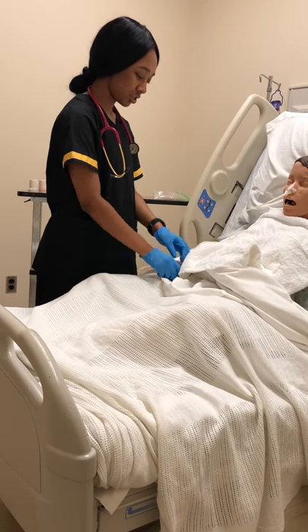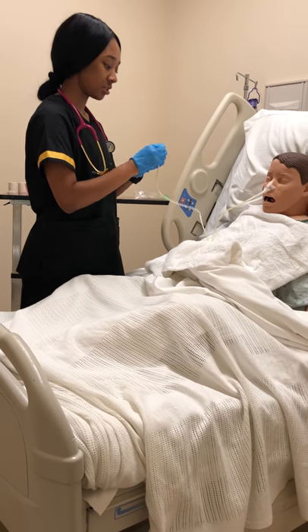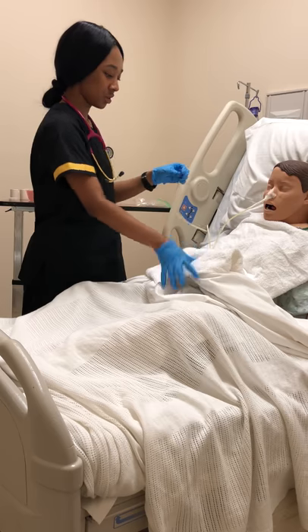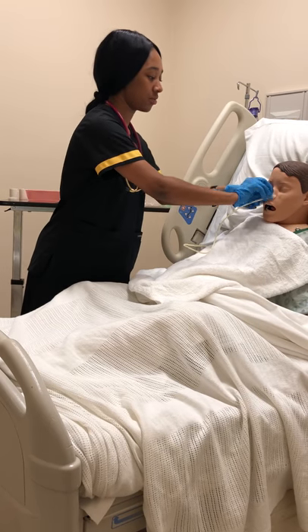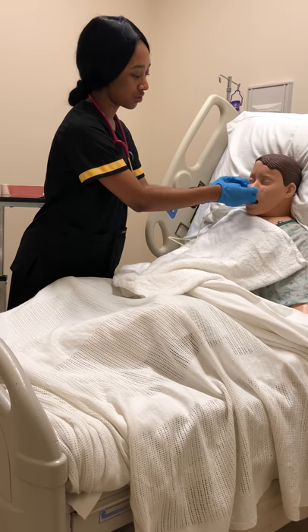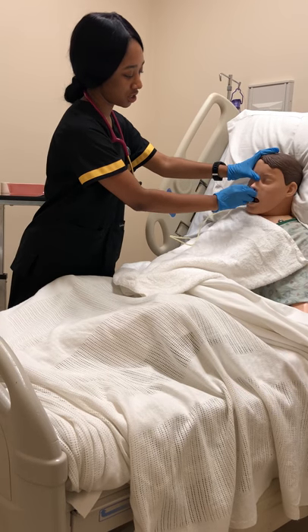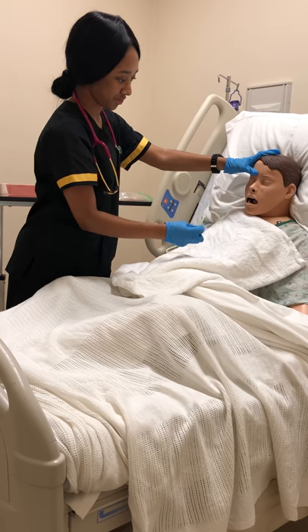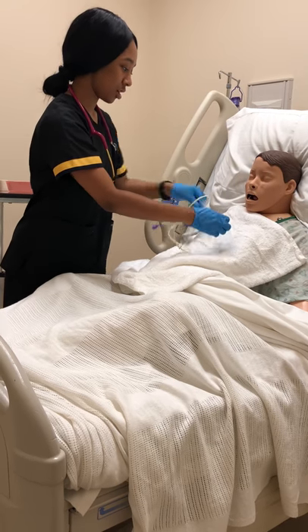I'm going to flush the tube with 10 ml of saline solution and now I'm just going to remove it. So Ms. Johnson, I'm just going to remove the tape off your nose and then I'm just going to have you breathe in for me and then let it out. Okay, great Ms. Johnson, that's it and I hope you have a great day.